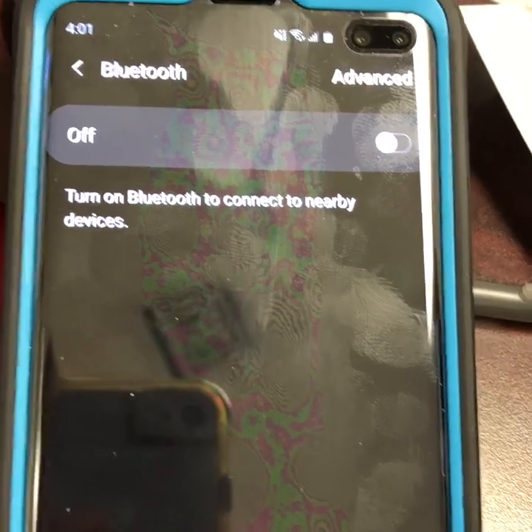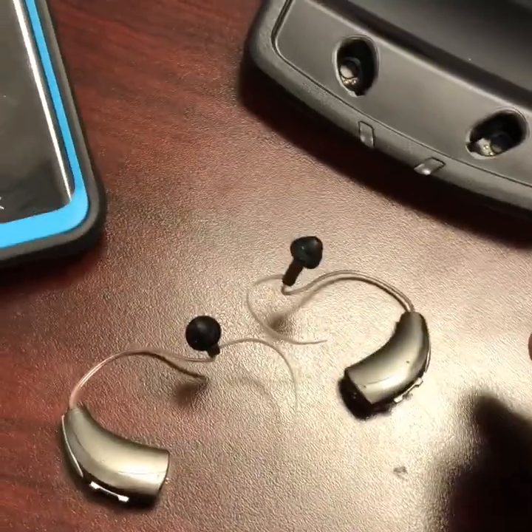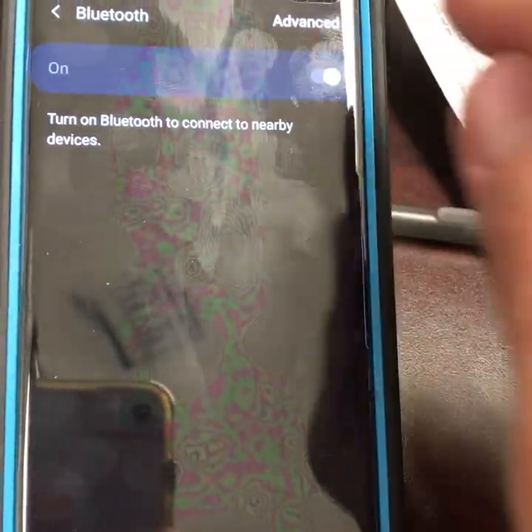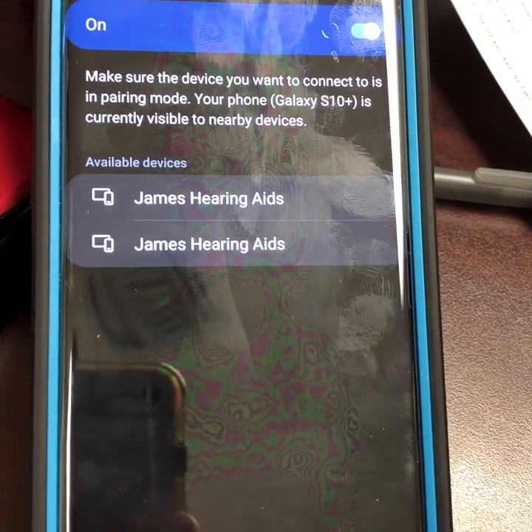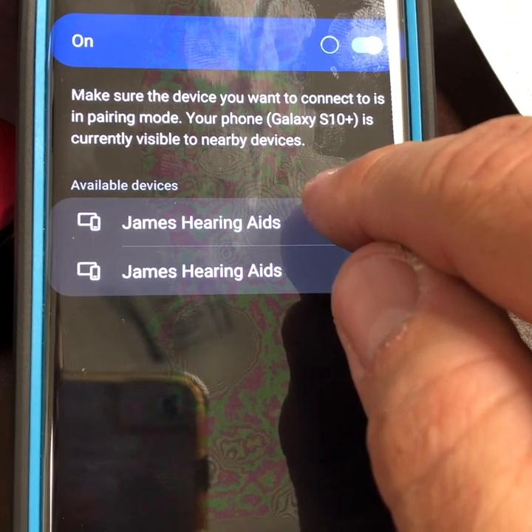Pull the hearing aids off the charger, close the battery doors to activate them, set them close to the phone, and turn the Bluetooth on. Bluetooth searches, it's found James' hearing aids. Select only one hearing aid, and wait.